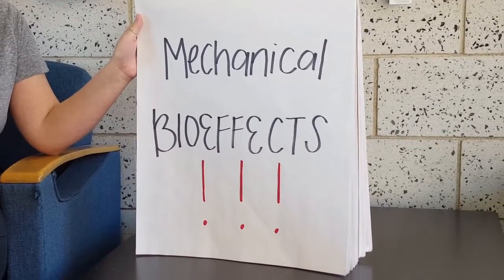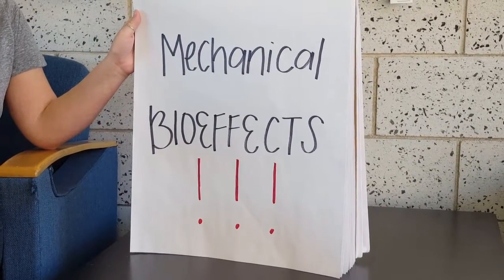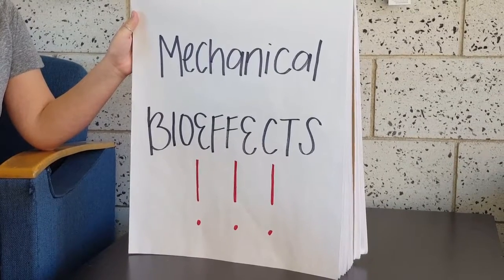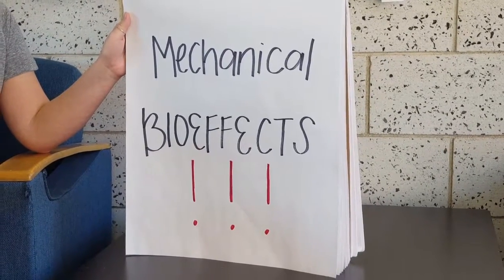There is a risk of mechanical damage from interaction between this sound wave and tissue in the body. An example of damage is cavitation. Cavitation is when bubbles are formed in the tissue, they vibrate or oscillate, and in extreme cases, they burst or implode.